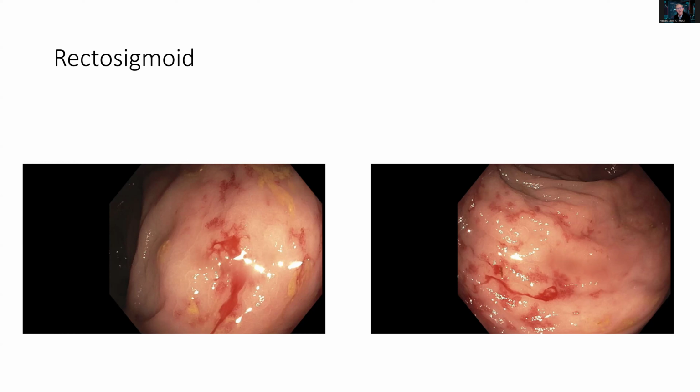So the endoscopist makes the diagnosis of vascular angiectasis and then goes ahead to cauterize and, fortunately for us, to biopsy the sample. So let's take a look at that sample here now.